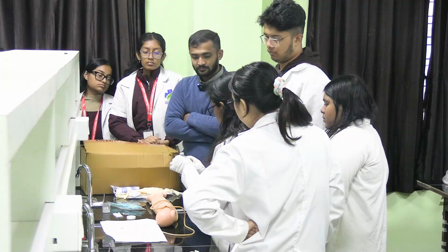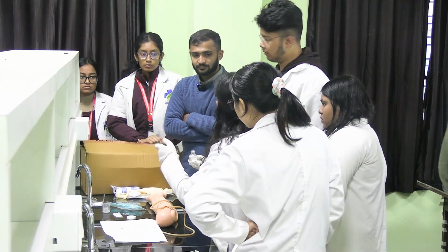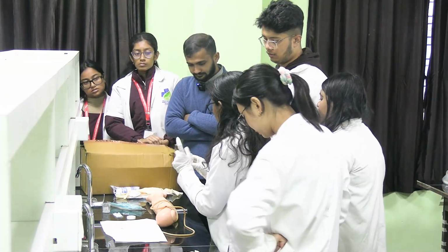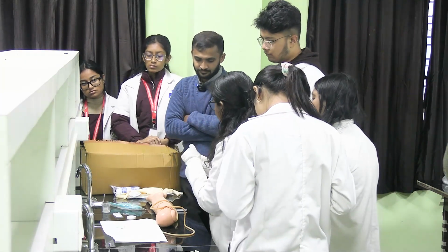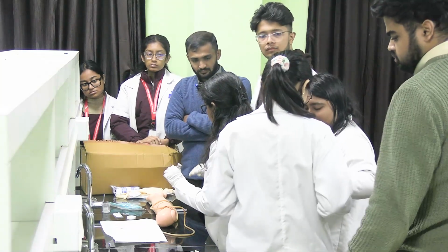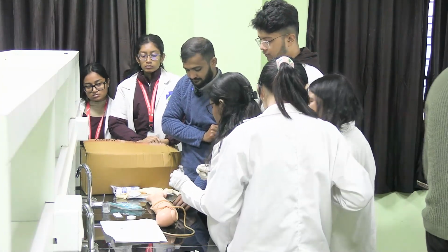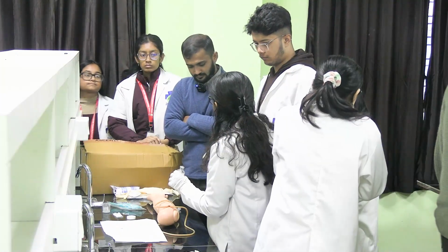If you're taking from the ampule, how will you take? Ampule, I have to break it with a gauze. If from a vial, it has a plastic cap and a rubber cap. I have to open the plastic cap, and this is the rubber cap. Before inserting, I have to disinfect the area. Then I have to take the needle.